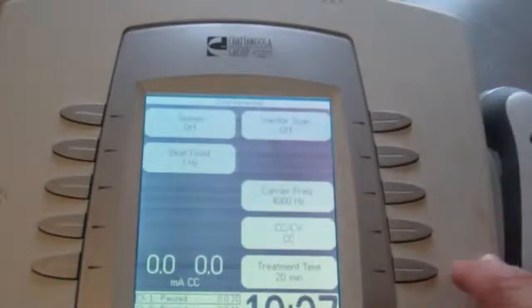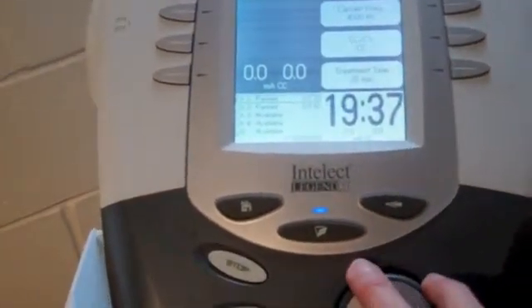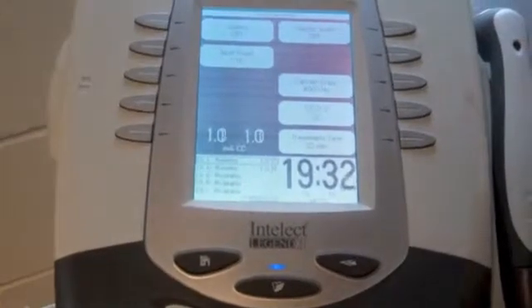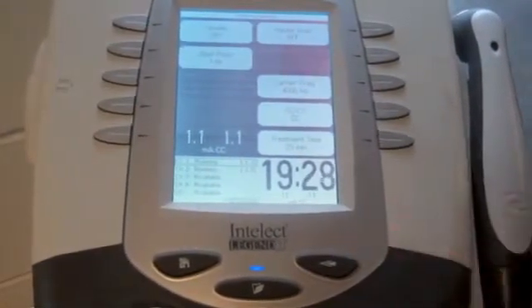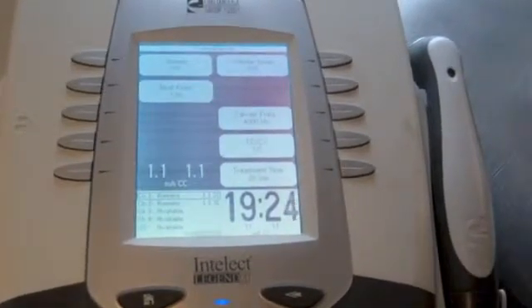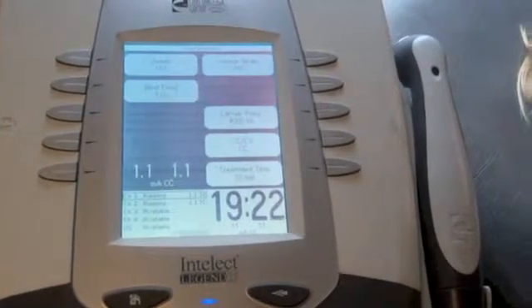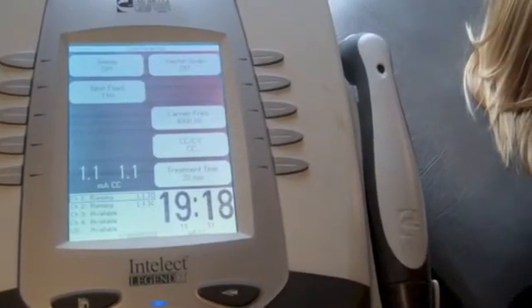Everything else is established as we want it to, and then we increase the intensity with the dial. Again, our intensity at this point, push start, and increase the intensity. The intensity needs to be at a motor twitch, so that's what we're looking for, is a twitch of the muscles of the low back. And once we've established that, then we have motor level pain control. So that is sensory and motor level pain control using interferential on the Intelect.